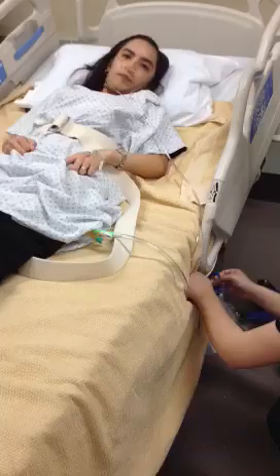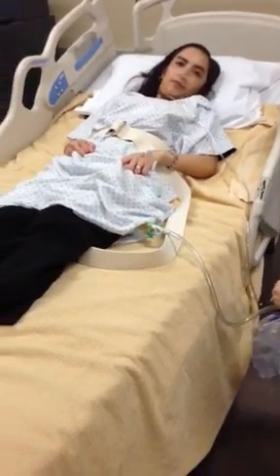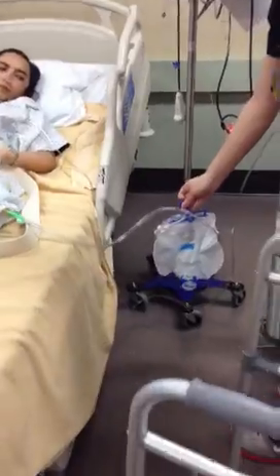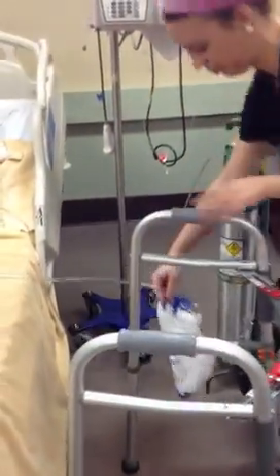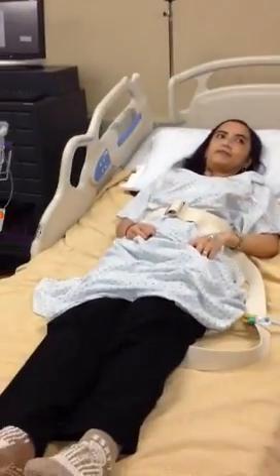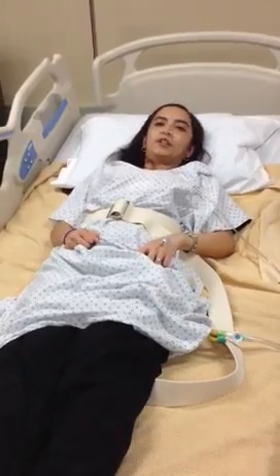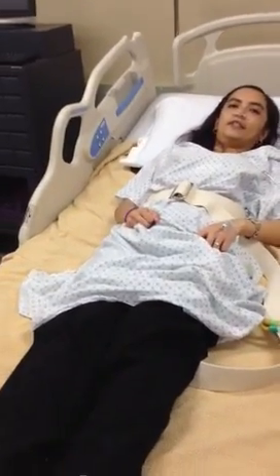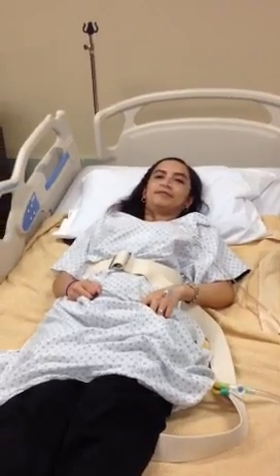One of the ways you can do so is by hooking it on their walker or wheelchair below the level of their bladder, like Lauren is demonstrating now. You need to make sure that there's enough slack so that you're not causing tension on the urethra, and that will also prevent injury to your patient.